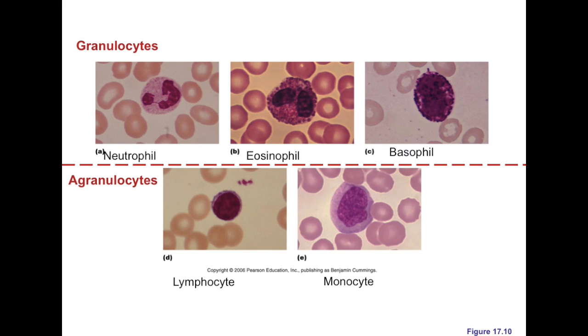All right, so here's a little better picture that shows you all 5 of our characters this week. These are all the white blood cells you're going to have to pick out. So of these 5, we'll flip over to page 22 in your packet, and you have them all here. You can remember them by never let monkeys eat bananas: neutrophil, lymphocyte, eosinophil, and basophil. And so that's all of them if you forget all their names.